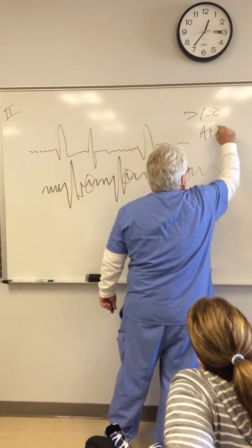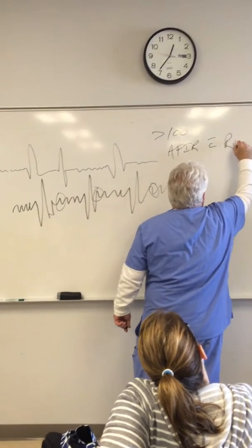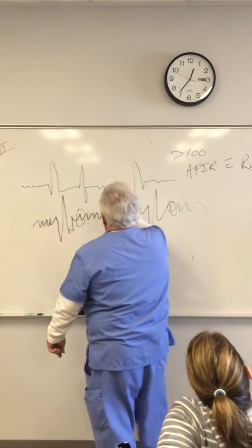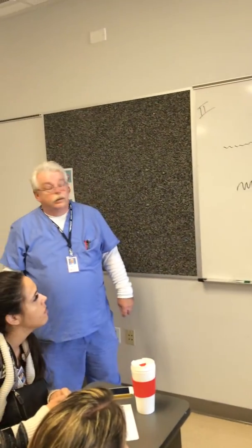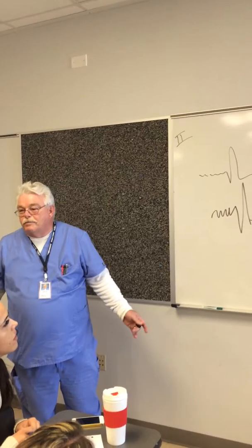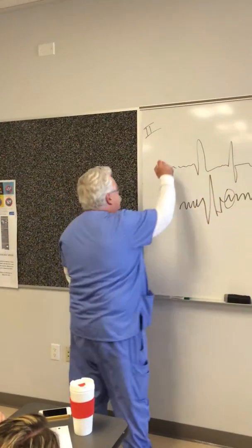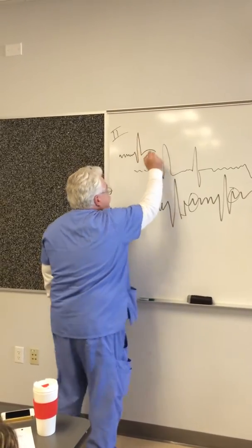What are those peaks in the AFib picture? Those are ventricle contractions. Those are QRSs. I told you I'm a lousy artist. The one in the first one, that's a QRS. It doesn't have the tail on the bottom. We're not worried about that.